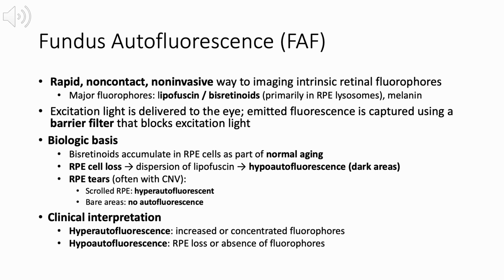Clinically, interpretation of FAF patterns follows these principles. Hyperautofluorescence indicates increased or concentrated fluorophores, while hypoautofluorescence reflects RPE loss or absence of fluorophores. Together, these patterns provide important insight into RPE health, disease activity, and progression in a wide range of retinal disorders.